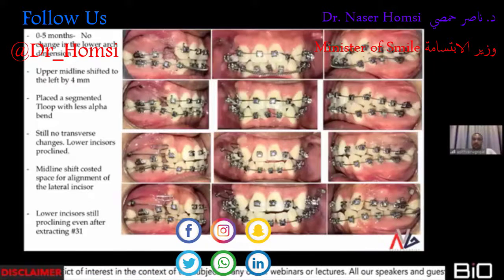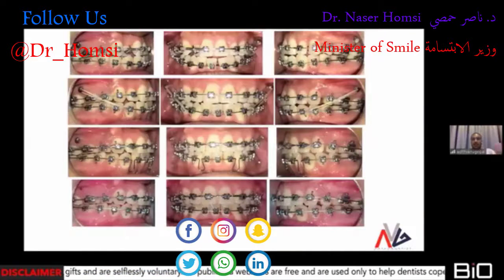Now there was a situation where the midline was moving, because I was trying to move this particular canine here, and I was getting this lateral incisor out, and the force of this coming out pushed these 3 to the right. And finally, the midline moved a lot to the right. Now I had no space on the left to correct it, so I had to extract a premolar, as you can see over here. So now I told him that I have to extract tooth number 2-4, and he agreed to that.